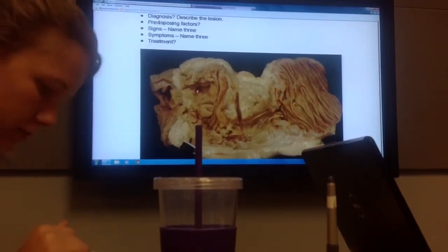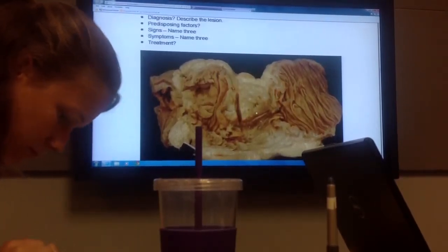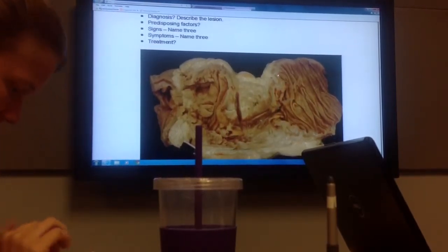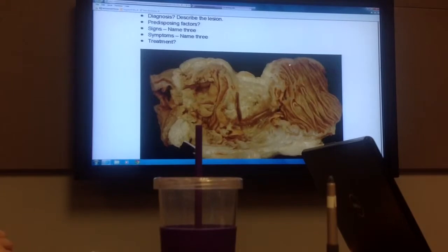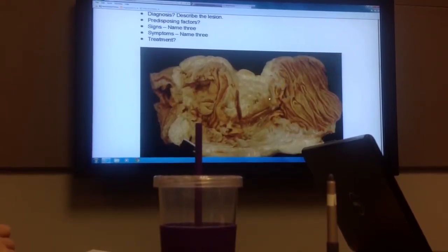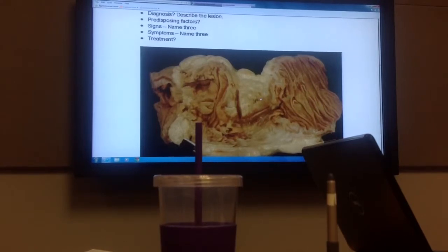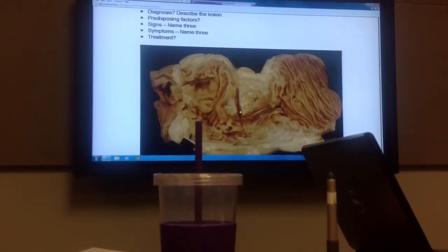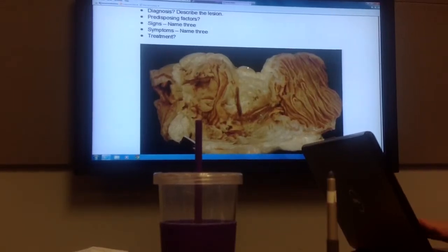If you tried to fold the lumen over or fold it back, look, let's follow this. Here, this line is the mucosa. See how it goes up here, down here? So this is the mucosa. This is something that's between the mucosa and the outer surface.